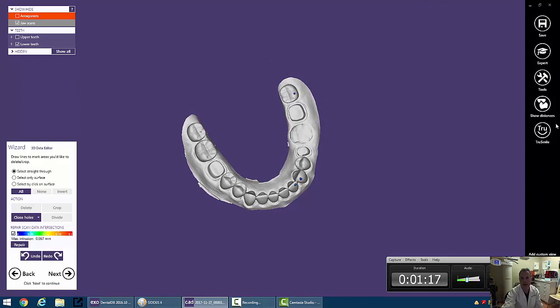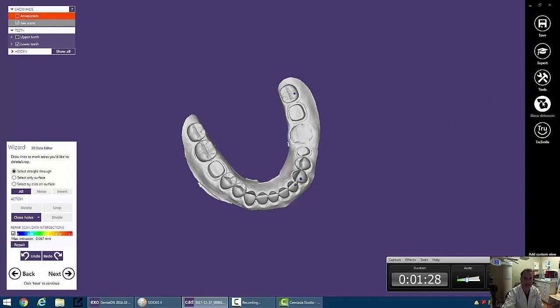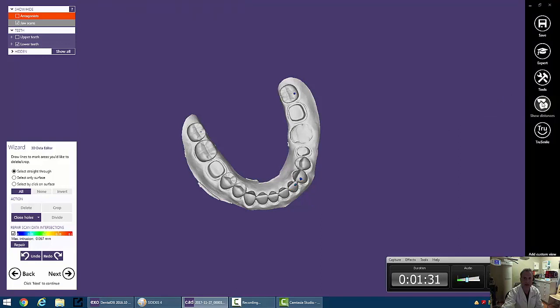To the right, we have a few things that we can play with. We'll talk about TrueSmile later on. But you may notice that I have some occlusion on some teeth, and I've got some colors here. This is the show distances icon. And we can turn that off and on if we wanted to.